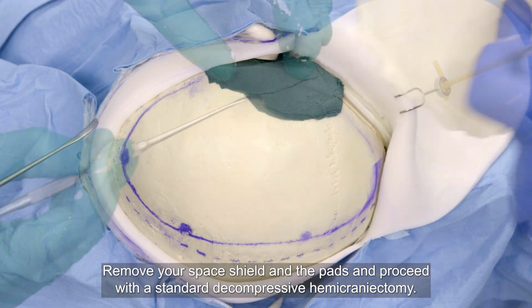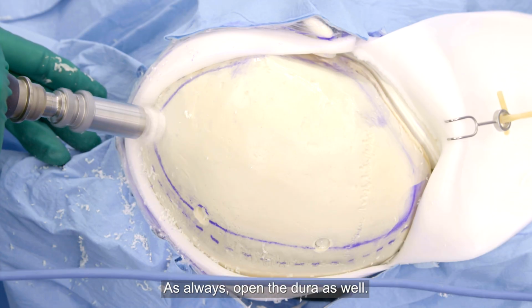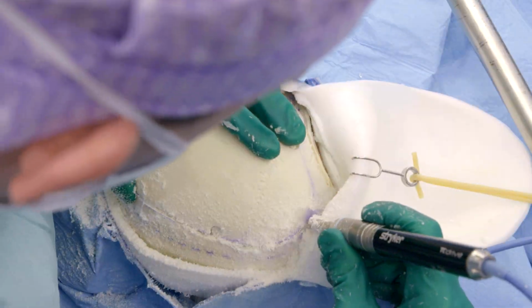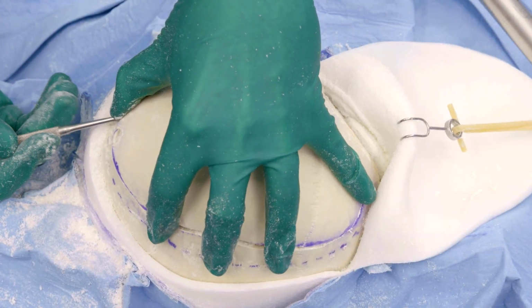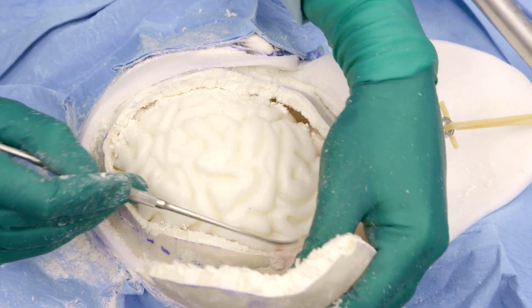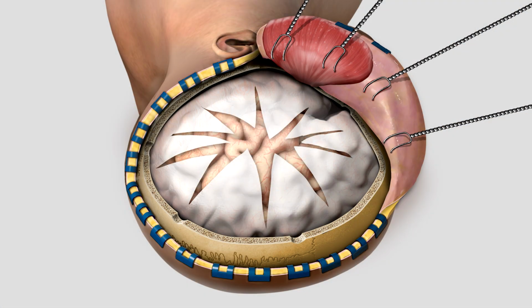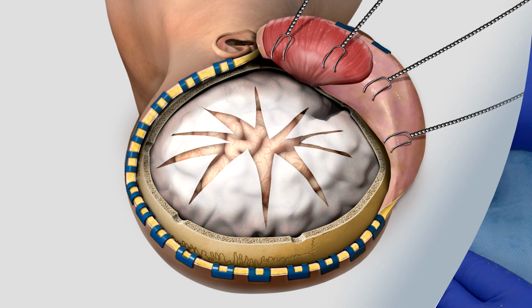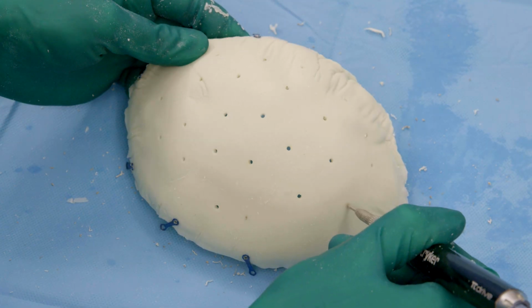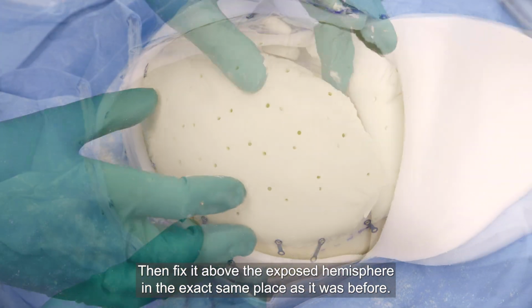Remove your space shield and the pads and proceed with a standard decompressive hemicraniectomy. As always, open the dura as well. Proceed by drilling a number of small holes in your space shield. Then fix it above the exposed hemisphere in the exact same place that it was before.